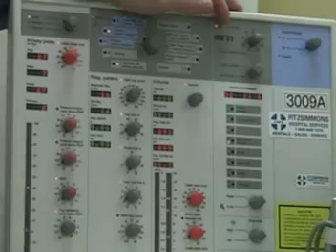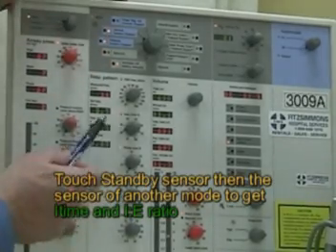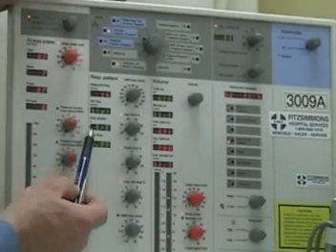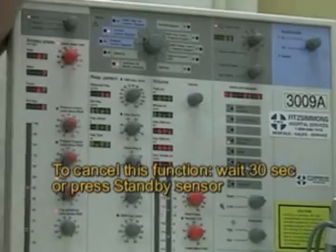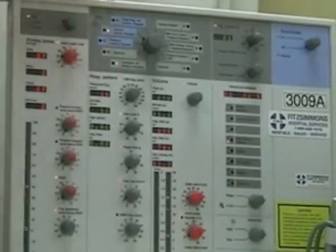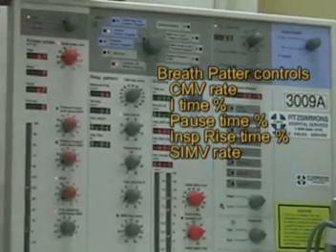One way to change the display is to touch standby and then the function key — this gives you total time in seconds and the I:E ratio in the second window. On some models this will change to liters per minute. To cancel, just wait a few seconds or hit standby again to return to normal readings. Going down the knobs: CMV rate, inspiratory time percent, pause time percent, inspiratory rise time, and in SIMV mode this knob becomes your SIMV rate.